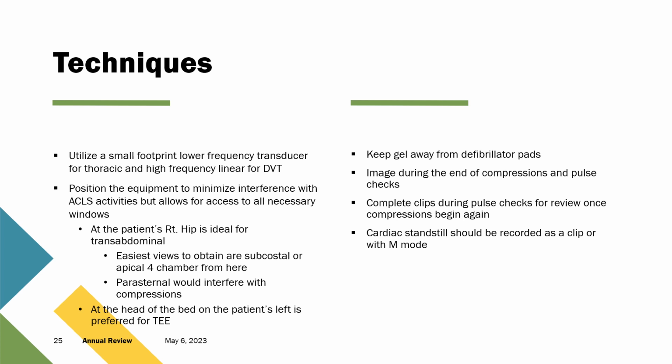It's important, if you're scanning externally without the TEE, that you keep your ultrasound gel away from the defibrillator pads, and that you're imaging at the end of compressions and during pulse checks. So you want to demonstrate how efficient those compressions are while compressions are being provided, and then you want to see what the heart's doing on its own when no compressions are being provided.